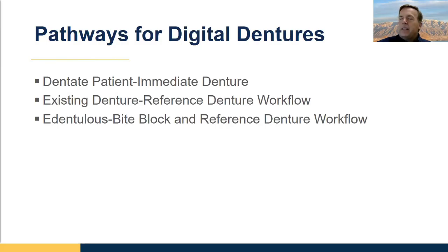So for a dentate patient that needs an immediate denture, we'll talk about that, and that is pure digital. We'll do an iOS scan of the arch before extractions. Then we'll talk about the reference denture workflow, which I think most people would agree is the best workflow for record taking for digital dentures today.